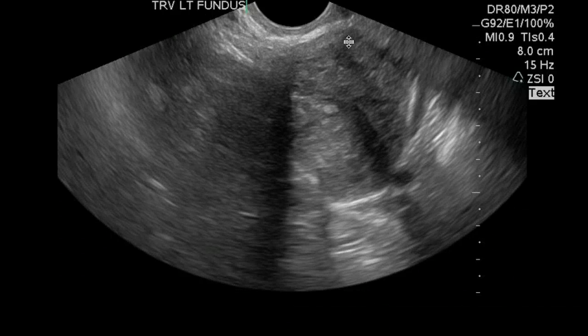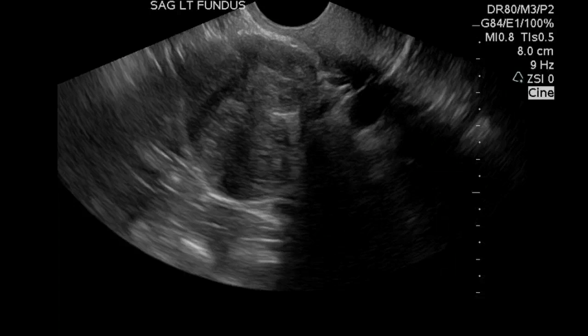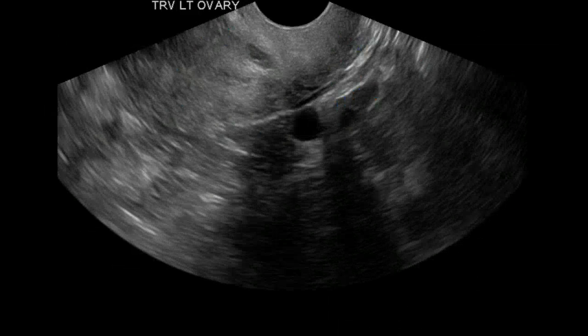And here's this other fibroid that we saw earlier on the transabdominal scan. Here it's left-sided fundal, and it looked subserosal. So here we've got a left-sided fundal subserosal myoma. There we're in pretty good shape as far as getting a good description on it. And this is a pretty classic looking fibroid.